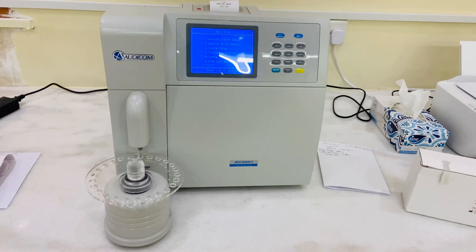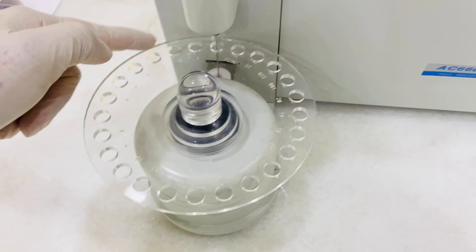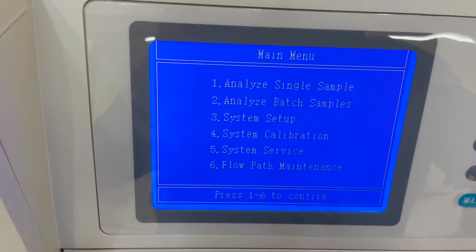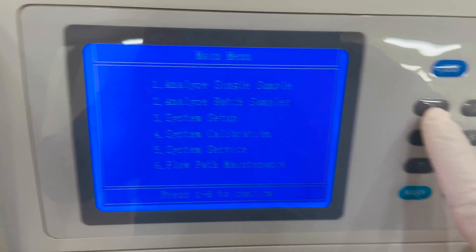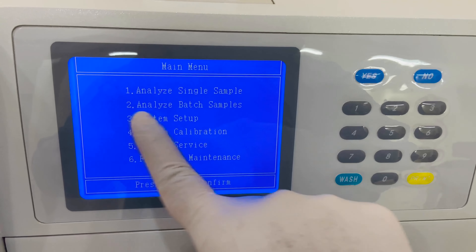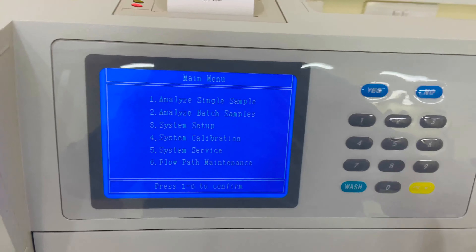Along with the machine you get one card, which is for the chromatographic column. In this machine you can run samples one by one, or you can run them as a batch.